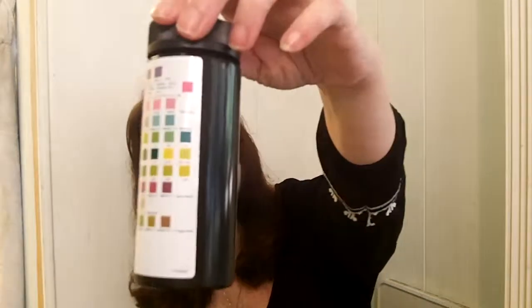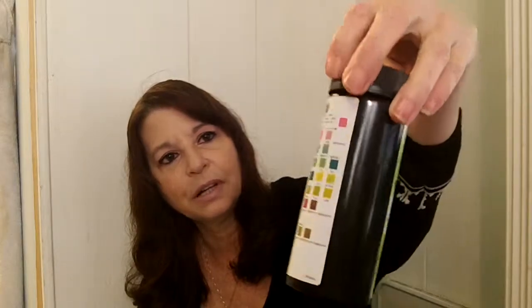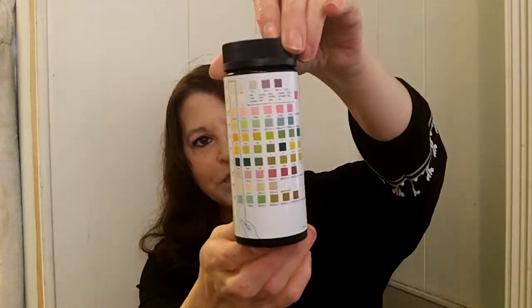And it comes with a color chart — if you see the side of the bottle, that's the color mark. After you use the strip, you just hold it up to that and you can see exactly what's going on.